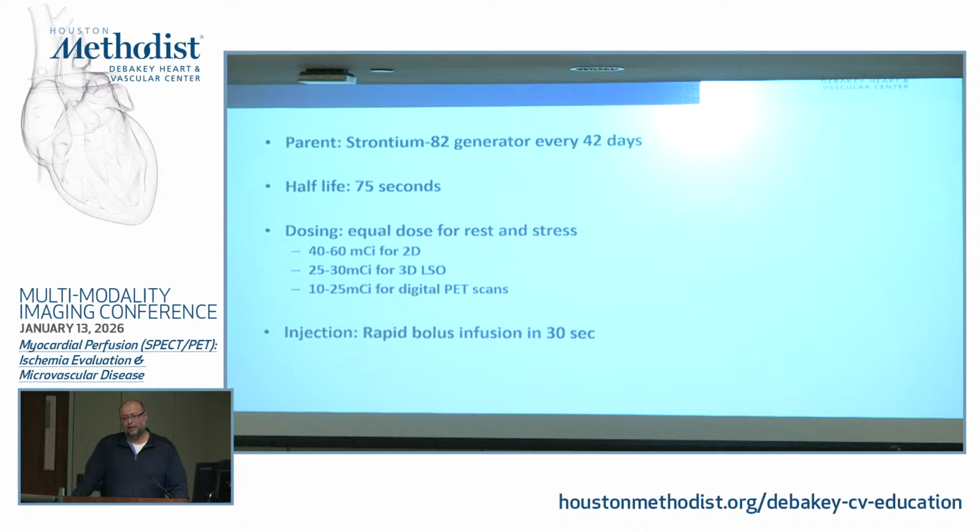If you do a lot of cases, like 13, 14 cases or above, then you run into the issue that you have to repeat QC in the middle of the day. So some practices who do a lot of cases start at 6, go till 10 p.m., then at around 4 p.m. or so, they have to repeat the QC as mandated by the FDA.